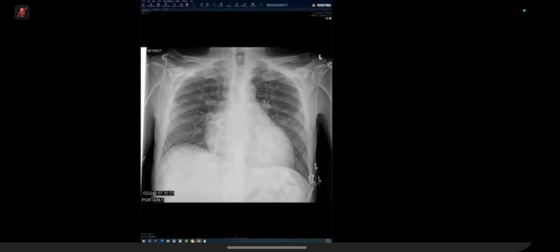Please tell me how to differentiate interstitial lung disease from pneumonia. That's probably a lecture rather than a two-sentence answer. But the simple answer is consolidation. You want to see haziness on a bigger scale and consolidation to call something pneumonia. Interstitial lung disease needs to give you a reticulation with lower lung volumes. You need to see reduced lung volumes to go down the ILD route. If you have general haziness, you need to talk about pneumonia, or if in doubt, pneumonitis is a good word, because pneumonitis doesn't really commit to an infective or idiopathic process. In the beginning, ILD, like drug-induced, can look like pneumonia. So pneumonitis is a good word to get out of that situation. But differentiating ILD from pneumonia is a long conversation that we can pick up another time.